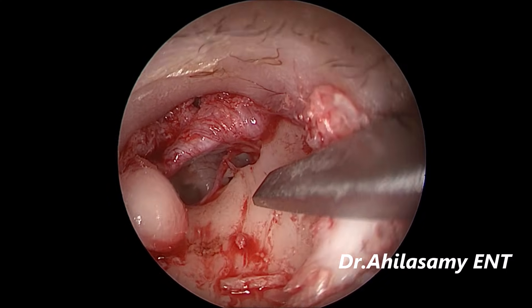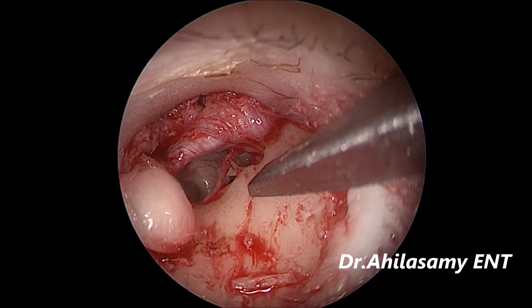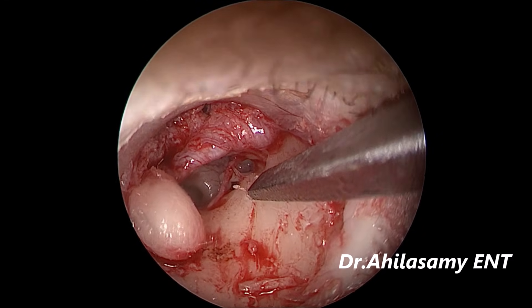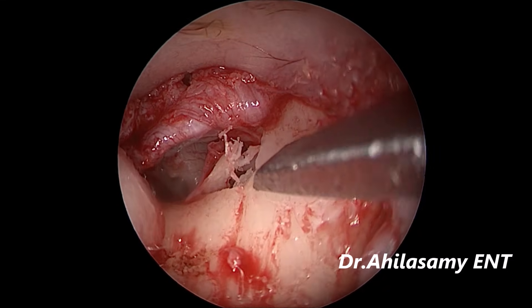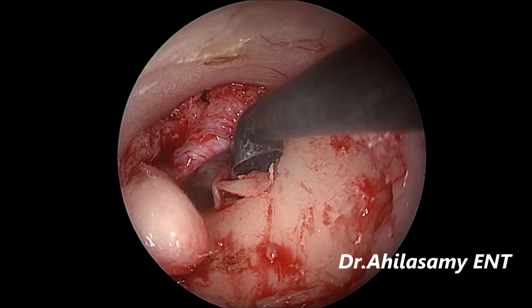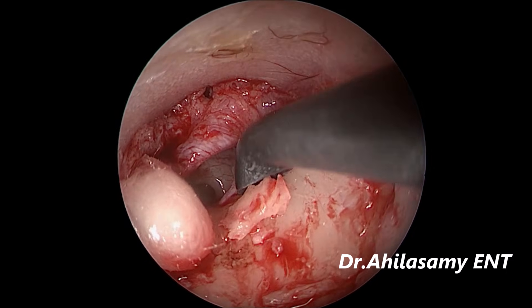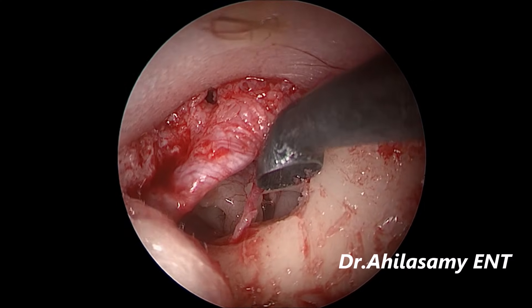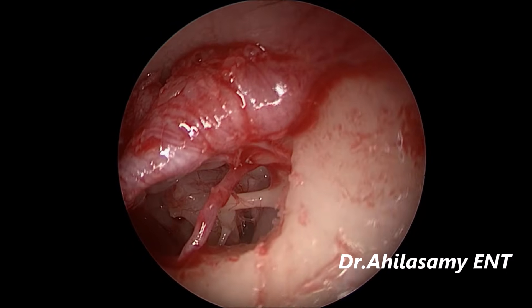Sometimes I use a 2 mm chisel to take out the bone in one chunk. This bony chunk can be replaced also. See — only a couple of strokes. With your left hand you are holding the endoscope and with the right hand you are holding the chisel, and you ask the assistant to tap it gently. In one stroke you get such beautiful and full exposure. Then with the curette I clean the little raw bone.